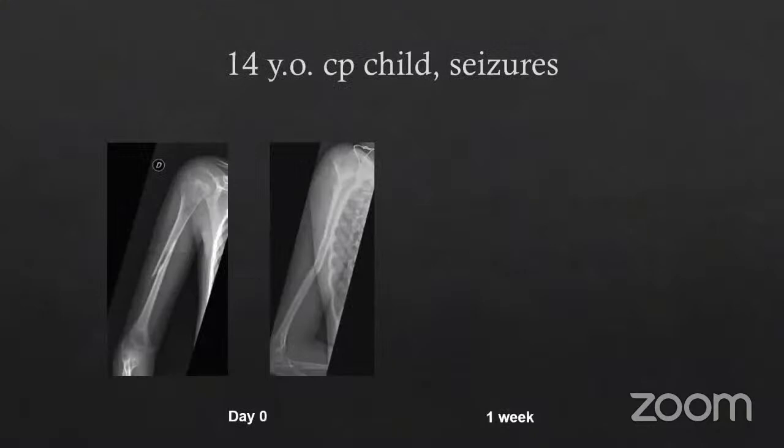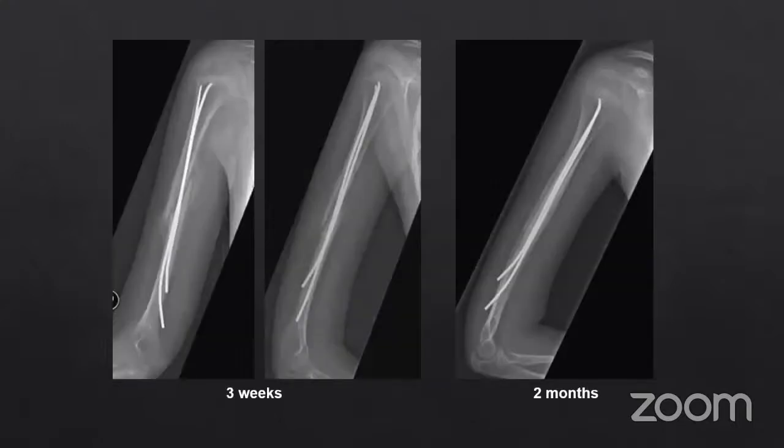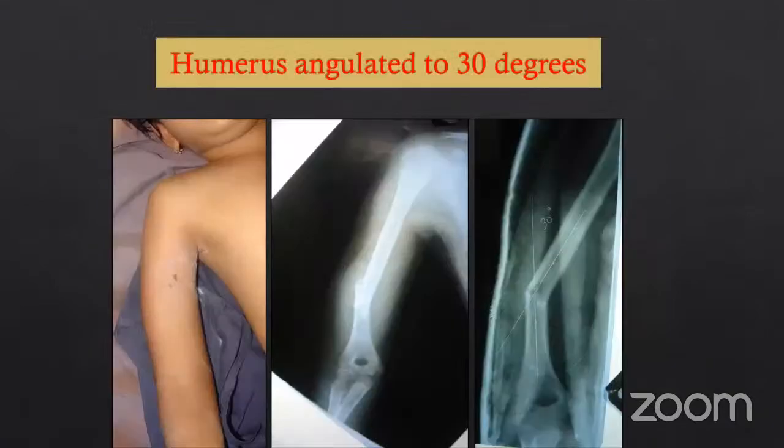Now, special situation. This is a 14-year-old spastic child with seizure disorder. It's very difficult to control these children with arm-to-chest strapping or any kind of humerus cast because they don't tolerate cast well. In these situations, elastic nailing may be considered where the child has a neurological problem and holding the child with a cast may be very, very difficult.